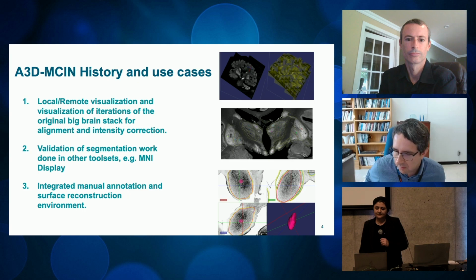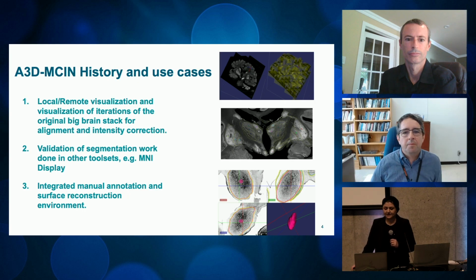After that, they upgraded A3D to make manual annotation and surface extraction possible from these 2D manually painted sections.